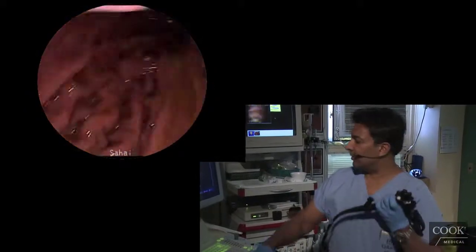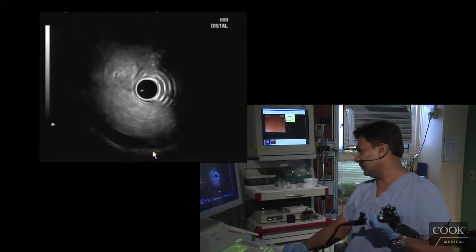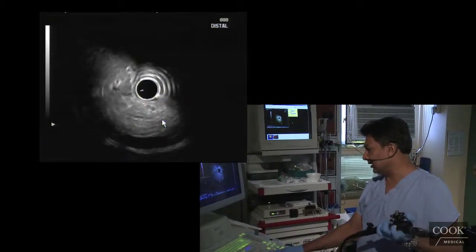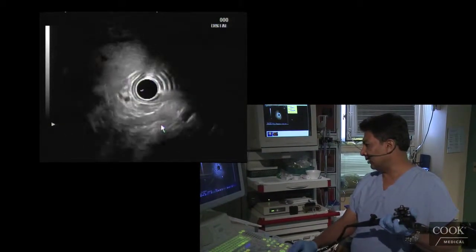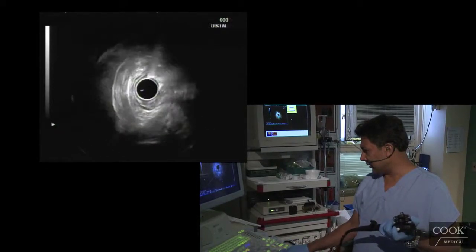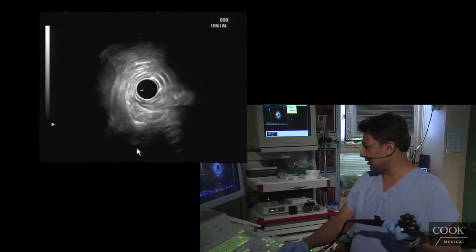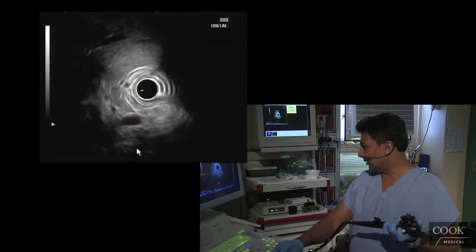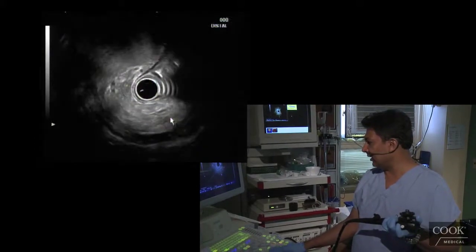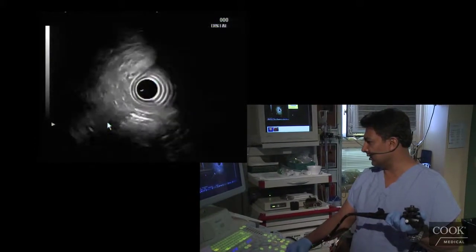So I have to go into the stomach and then come back. You see the pancreas here. Normally you start at the aorta up here — it's down here. You push in, you see the celiac takeoff, what they call the whale's tail over here, then you push in and you get the portal vein, the splenic vein under the pancreas right there — that looks good.